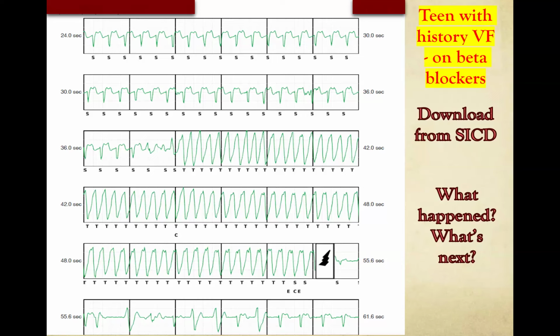Transvenously, I mean. So I think that if it were a patient in whom putting in a lead would be very challenging, like a single ventricle patient, you would try hard to avoid having to put a pacemaker in. I really hate it when my medical therapy forces me to put hardware in a patient, but that does sometimes happen. But it's an easier decision when someone has a transvenous device, because upgrading someone from a transvenous single chamber ICD to a dual chamber is not very difficult.